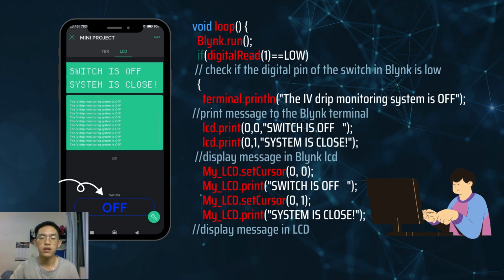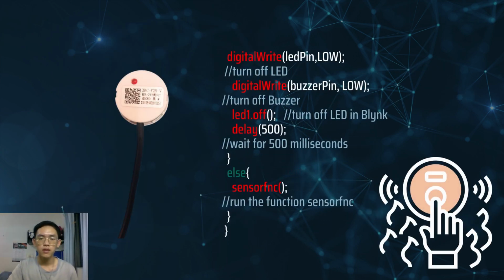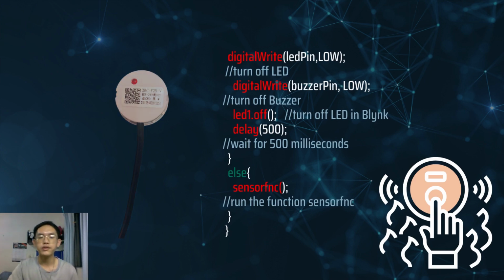If the switch is low, the LCD will display the message "Switch is off, system is closed." After that, it turns off the LED and buzzer with digitalWrite, while the LED1.off function is used to turn off the Blynk LED. The code will wait for 500 milliseconds with the delay function. If the state of the switch is high, then it will skip the if statement and straight away come to the else statement. The sensorFnc function is called and the monitoring system operates.